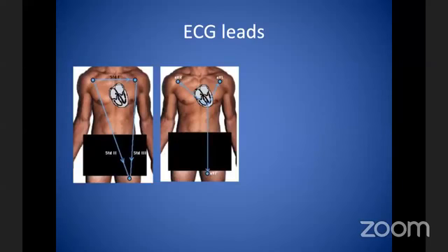These were the chest leads. Now we're talking about the limb leads. So you have AVR, as the name suggests, on the right arm, AVL on the left arm, AVF on the feet or the legs. So obviously this is looking at the heart from the bottom end. This is looking from the left side. This is looking from the right side. And then you have leads 1, 2, and 3. So 2 and 3 looking from the bottom end, and 1 is on the left side.